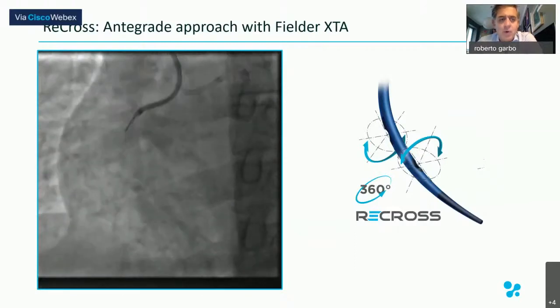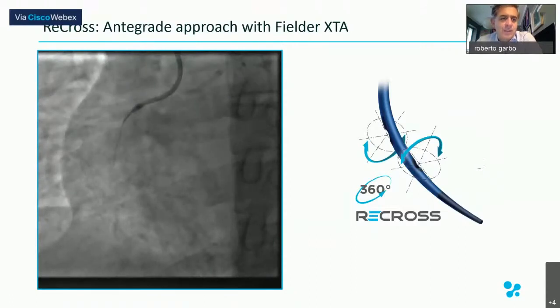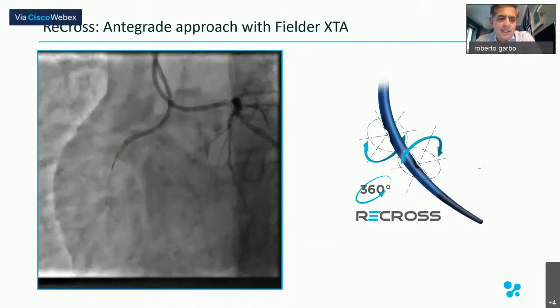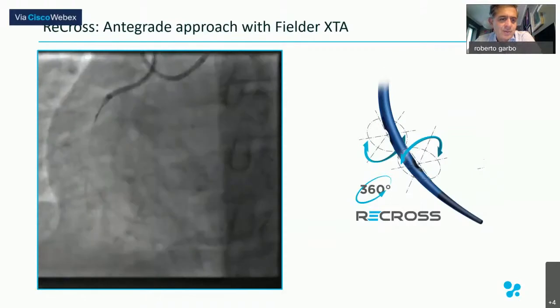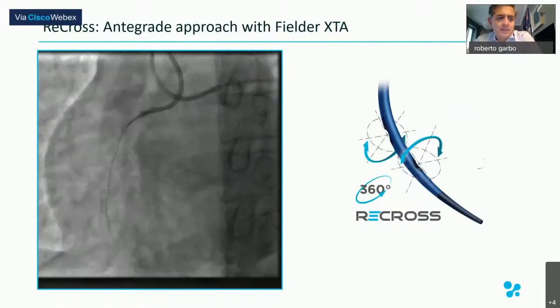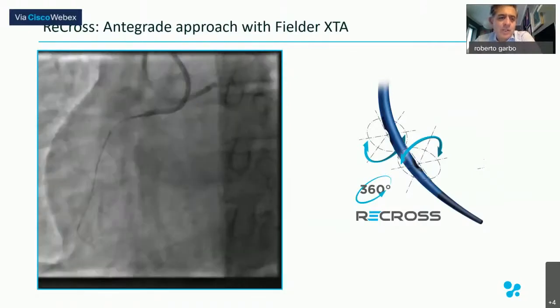It seems to be a normal microcatheter, and you can see the Fielder XTA. This is a fluoroscopy registration, live in a box, and it went into a side branch. You can see that I needed to push a lot, and I did not go in the right direction. I did the injection, and now, perfect.